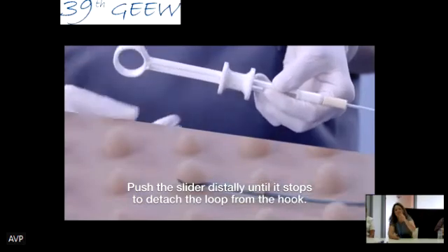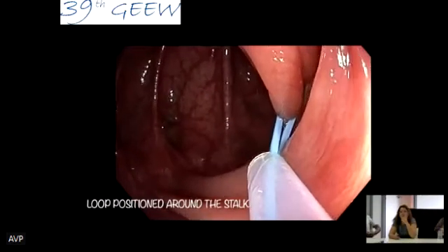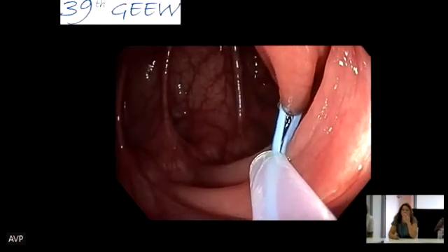Once you have the little plastic thing in place, you can release it. So the loop here is around the stalk. This is a big pedunculated polyp.